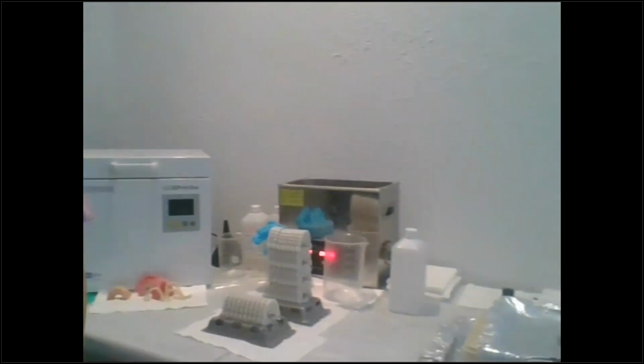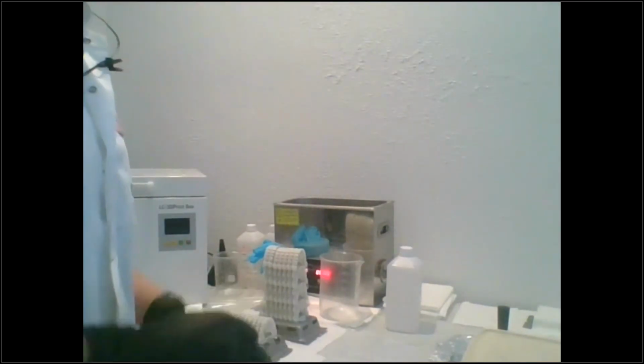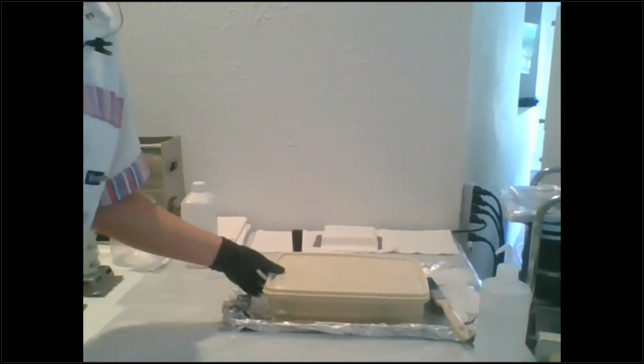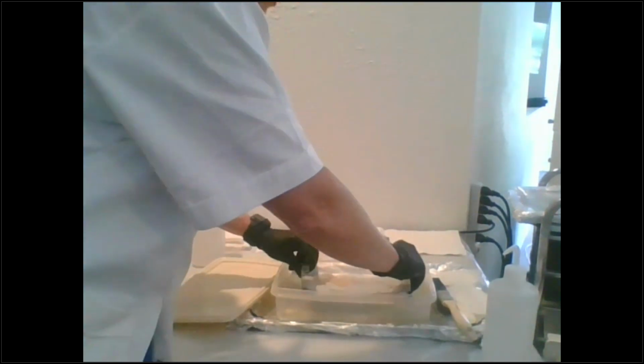This is what else my cleaning station has. So I always have a stack of white balls. I really like them. They're very thick. They don't have a lot of lint in them. I have a Tupperware container that I got from, you know, wherever, Walmart or something, and it holds the build platform stand really well.